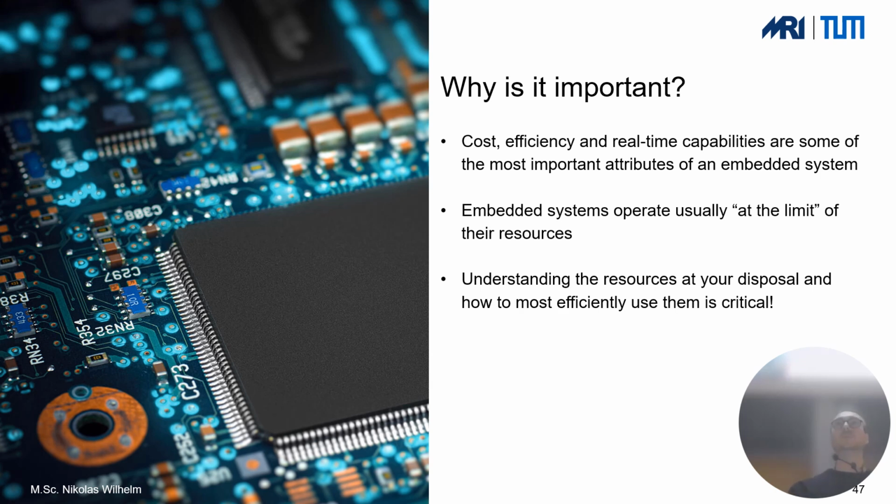You can just put this very small microcontroller there on your device, maybe directly, and you have all the logic that is mainly required in reading the sensors and doing all the main logic of handling things on that very small chip.